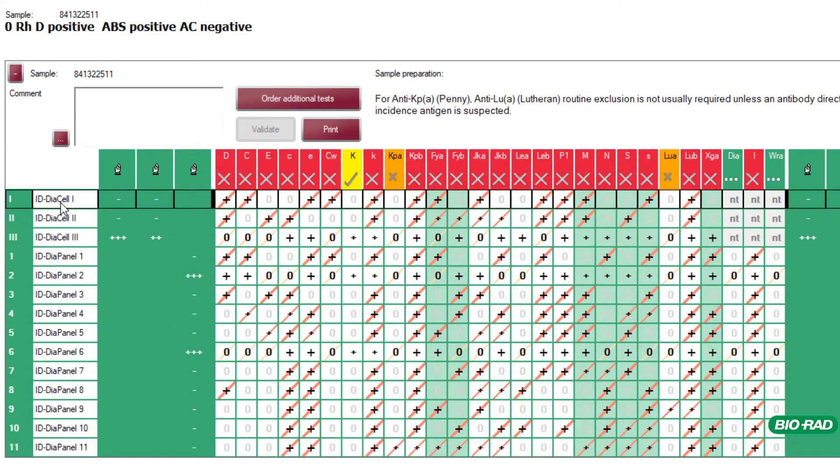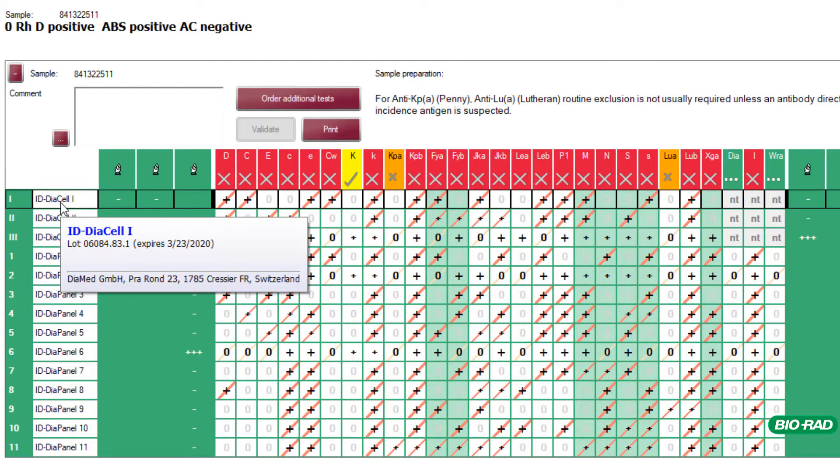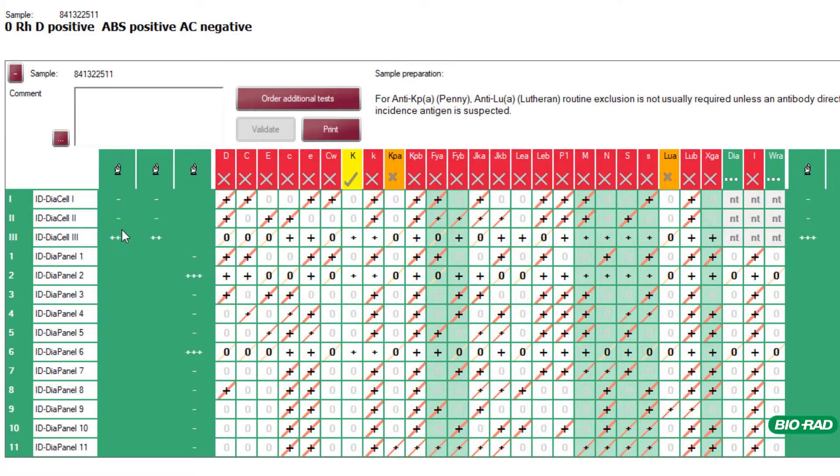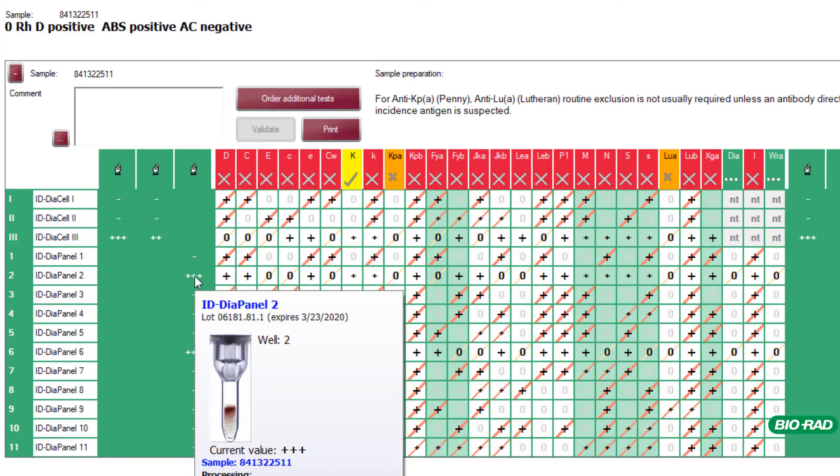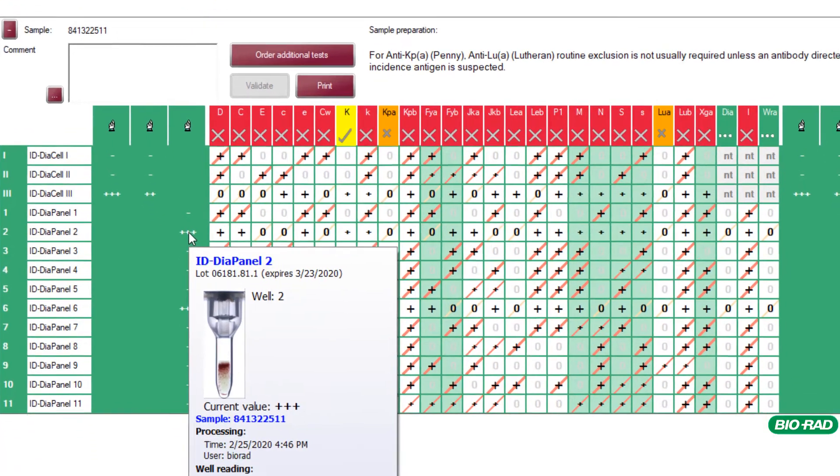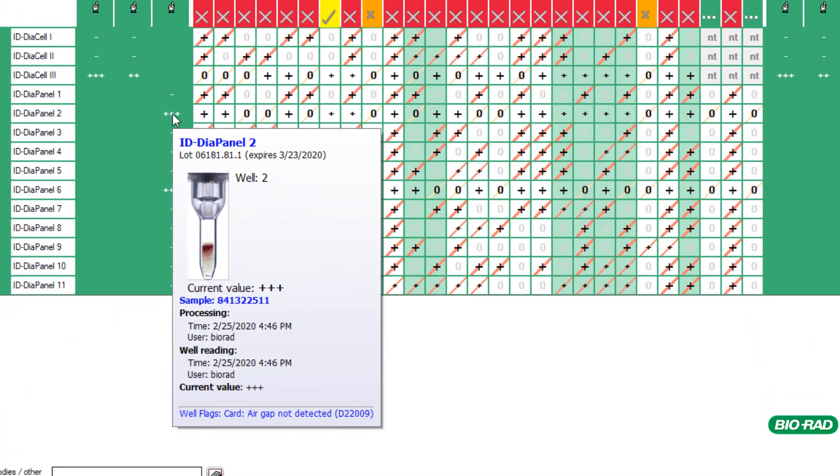The user can hover over different sections of the digital antigram to see more information. Here we can see the reagent red cell lot and expiry. Hovering over individual reactions will produce a well image and any relevant information on that test including user, date, time and if that result was changed manually.